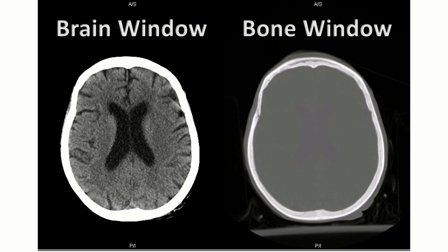In the bone window, the neutral density point is closer to that of bone, so you can clearly see the outer table, the inner table, and the interspersed diploë. The cranial cavity appears empty because the brain parenchyma is less dense than bone — it's underexposed, so to speak. Switching to the brain window, the neutral density point is closer to that of the brain parenchyma, so you can see gyri and deep sulci. However, like an overexposed image, the bone loses all its detail.